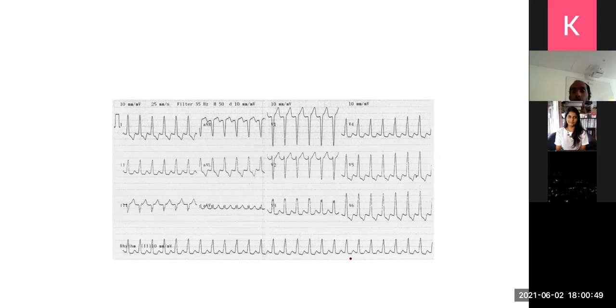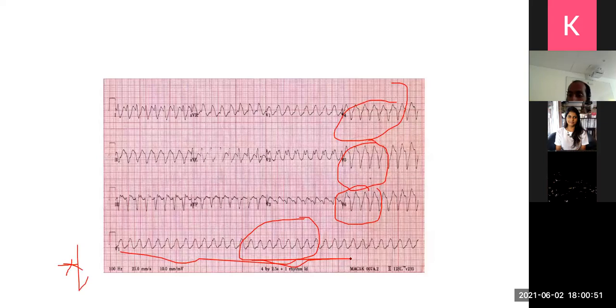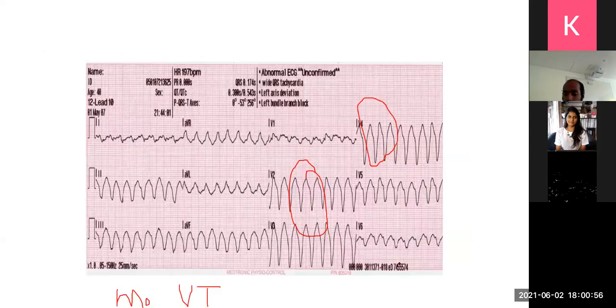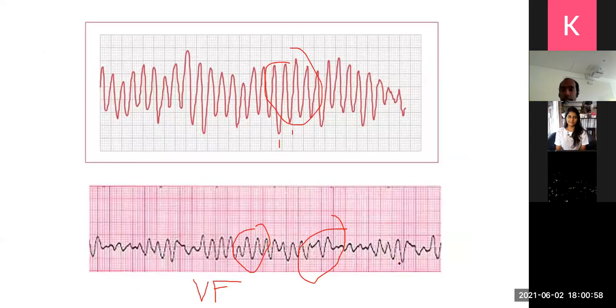හරිනේ. හරි දැන් මේ rhythm analysis වලින් තියෙන ප්‍රශ්නෙට sorry. So Bindula, yes, polymorphic VT is also called Torsades de pointes. Okay, polymorphic VT මේ උඩ තියෙන එක is also called Torsades de pointes. It looks like a twisted ribbon. Torsades de pointes means a twisted ribbon.